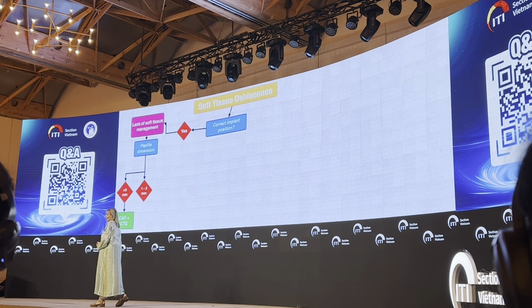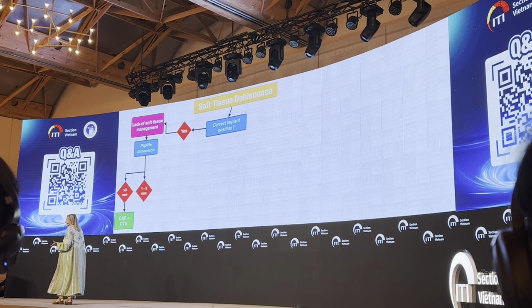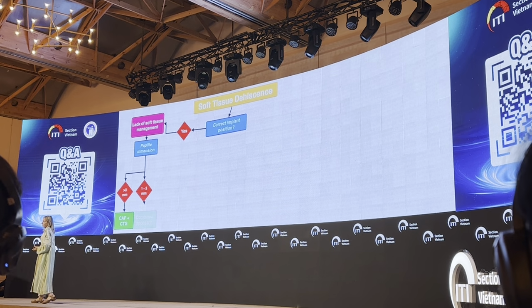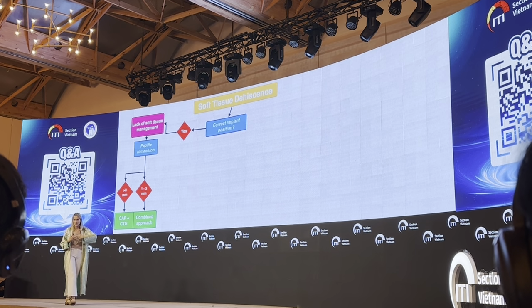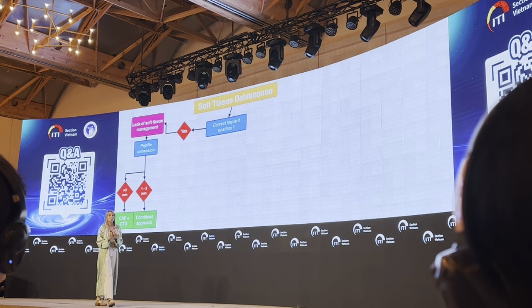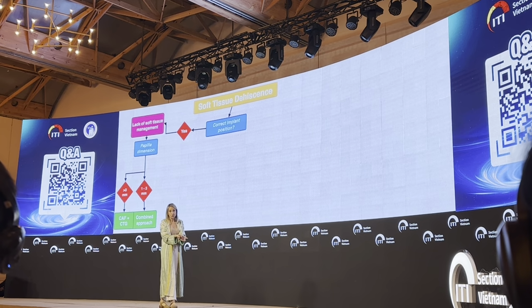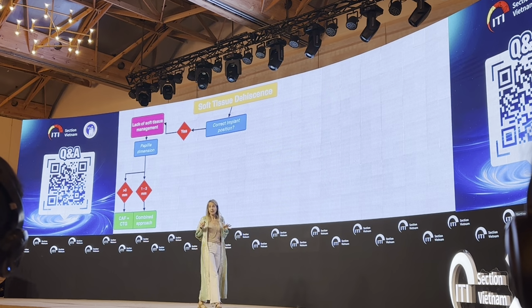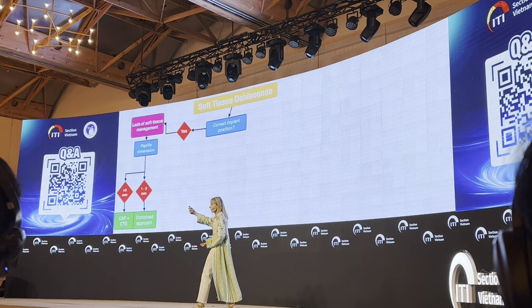What happens if we don't have 3 millimeters in height of peri-implant papilla? We cannot simply perform the surgical technique because we don't have enough interproximal soft tissue to ensure the stability of the coronally advanced flap. And this is something that we learned from mistakes.